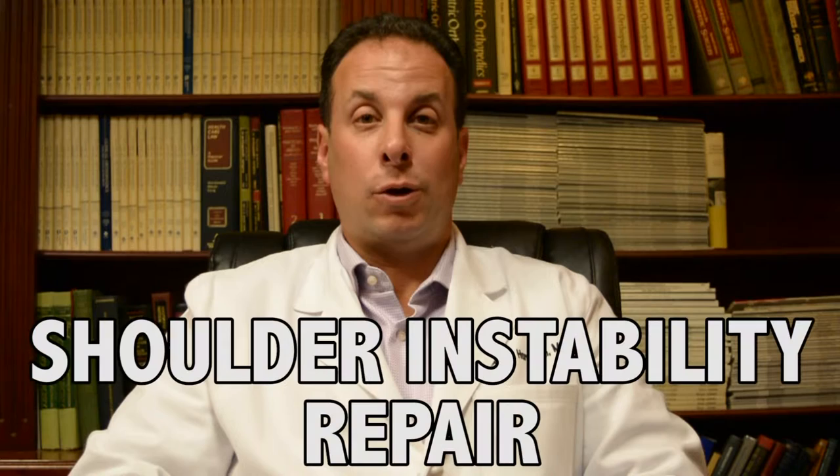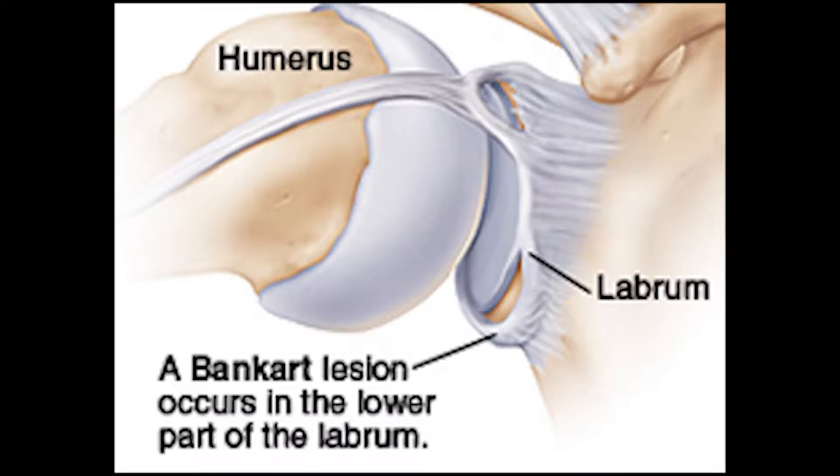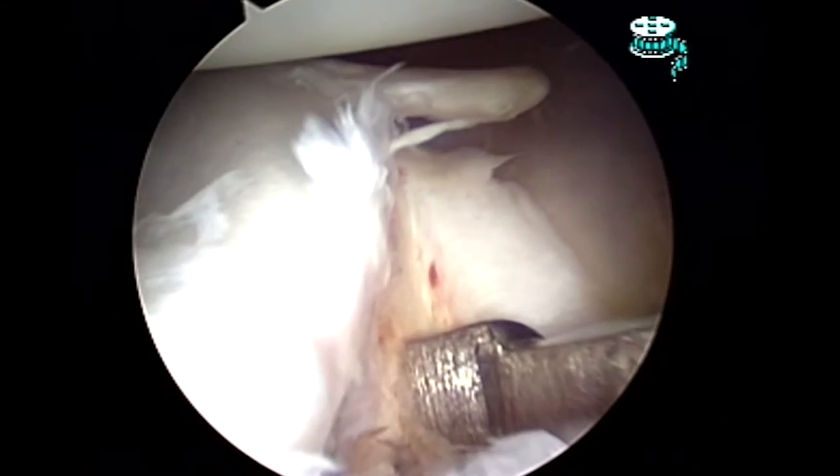When a shoulder dislocation occurs, the labrum, as well as the ligaments in the shoulder, can be disrupted from the shoulder socket. In this case, we have a patient who had a traumatic shoulder dislocation with a labrum tear, as you can see where my instrument is. This is normal labrum attached to the socket, and this is the area that is torn off.